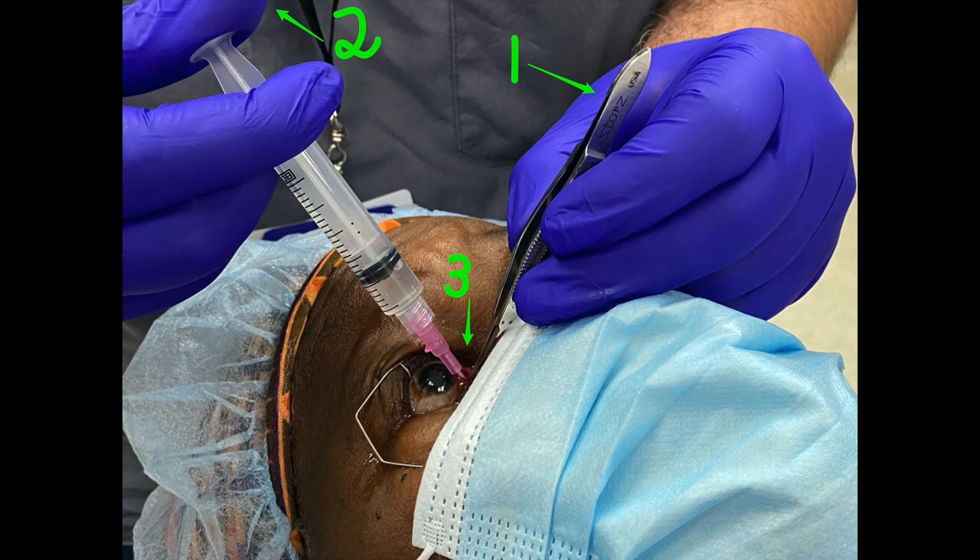Three key points. First, do not let go of the conjunctiva and the Tenon's capsule all through. Second, when you're going in with a syringe, you need to go ready to shoot — a finger on the plunger, as you can see in number two.